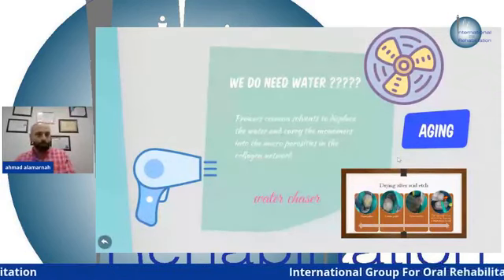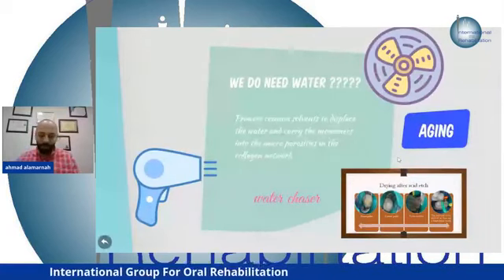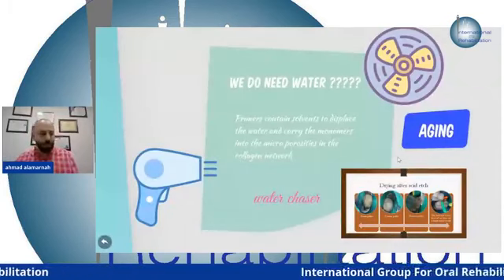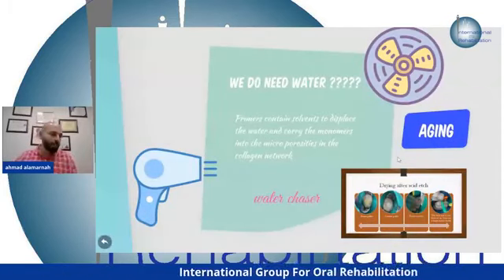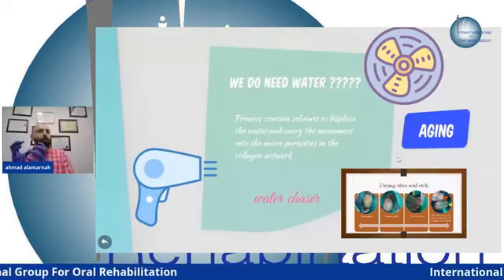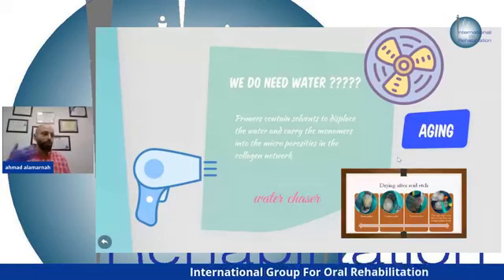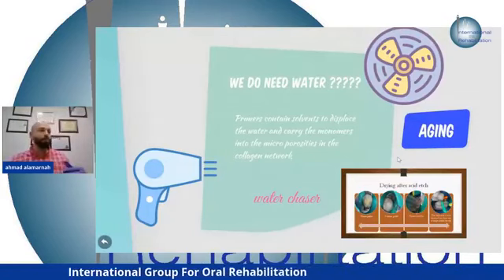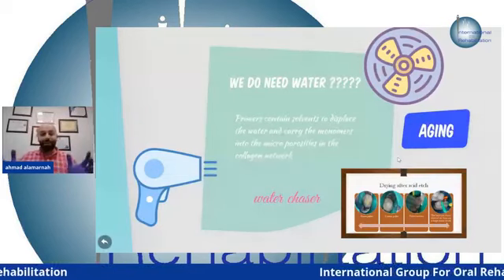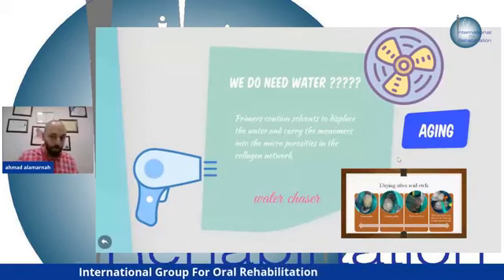The primer is a solvent. Maybe it's acetone, sometimes it's ethyl alcohol, and sometimes it's water, and the bifunctional monomer. We all know that the composite is hydrophobic. So the introducing of monomer with its bifunctional monomer creates a link between the two walls, the hydrophilic and the hydrophobic wall.